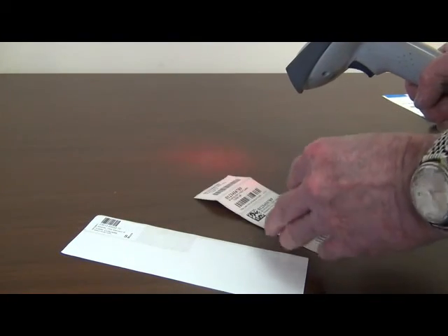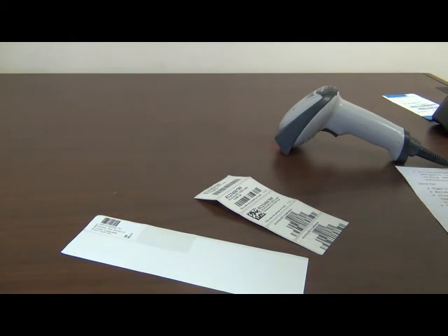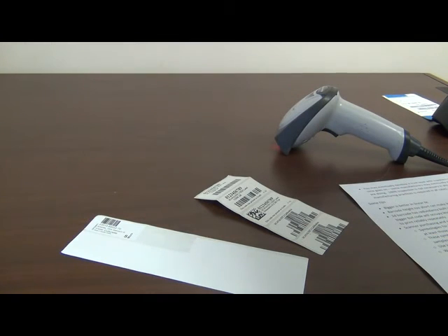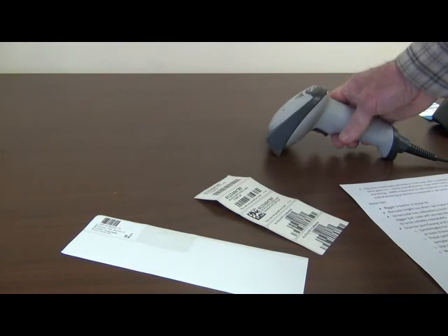Same with 2D codes. So that's a good choice for, for instance, operating rooms or nurses' stations where the nurse may be wearing sterile gloves and doesn't want to take the glove off, or doesn't have an extra hand, which is most often. So this presentation mode is in most scanners. Some call it smart stand, some call it presentation mode. A variety of different terminology is used, but it's available on most scanners, so I'd search for that too. And it can still be used by hand. You can still squeeze the trigger and use it that way.